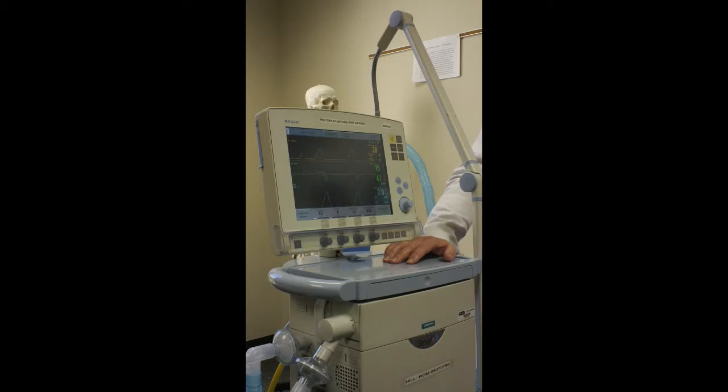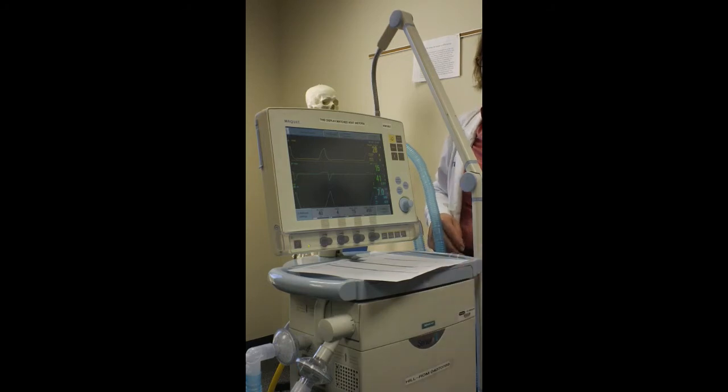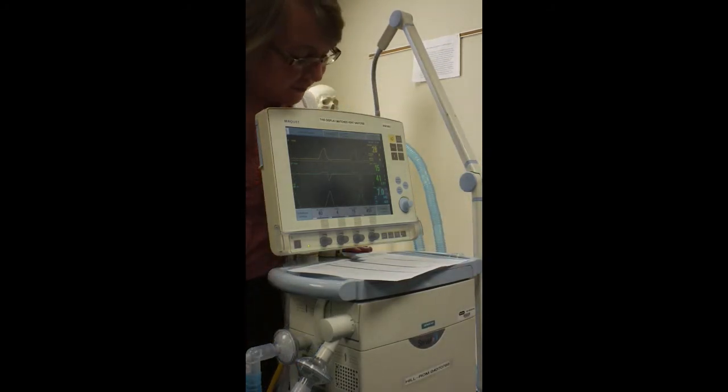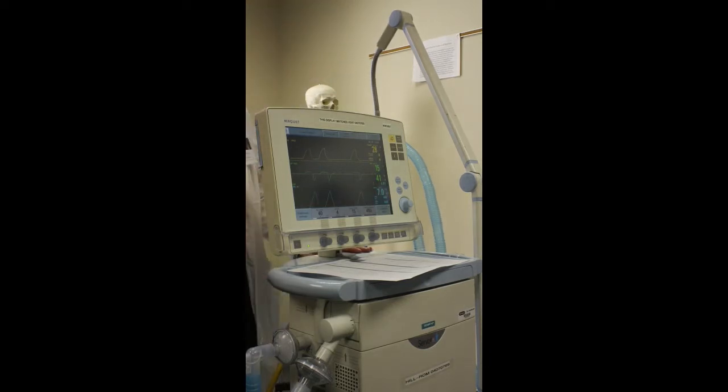Tidal volume. This tidal volume, we want exhaled tidal volume. Some vents measure inhaled and exhaled. Most just measure exhaled. Now this is one thing that's important to understand. When you deliver a breath, what's our tidal volume set right now at? 450. So here's our inspiratory, right here at the machine. 450 should be coming out.